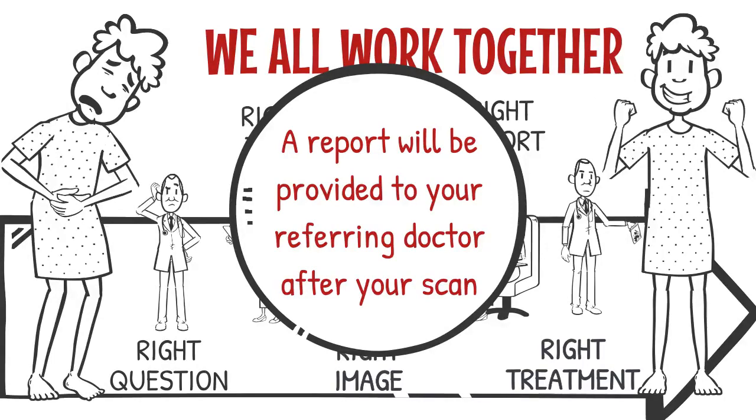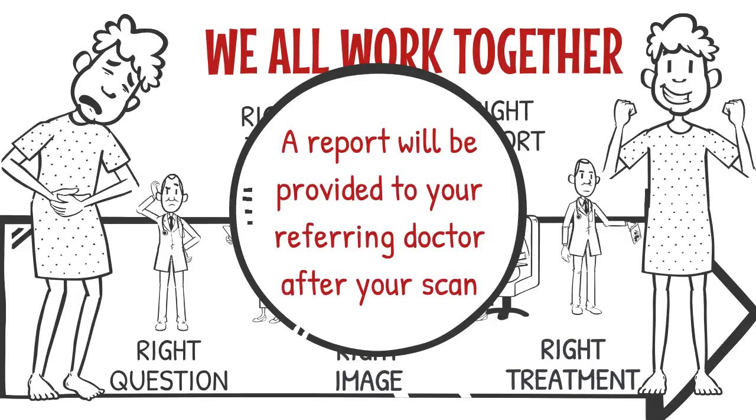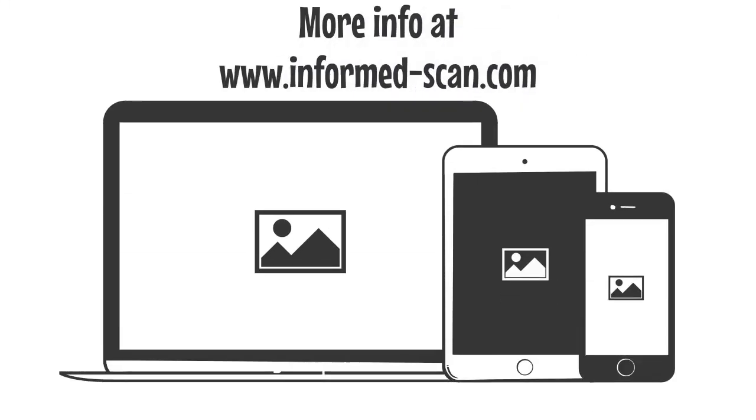As mentioned throughout the video, your hospital will provide you with information on their specific requirements. Feel free to contact the department before your appointment or mention to a member of staff on arrival if you are claustrophobic, as they will be able to give you some reassurance and make sure you are as comfortable as possible for your scan. Further information on MRI scans can be found in this leaflet or on this website.